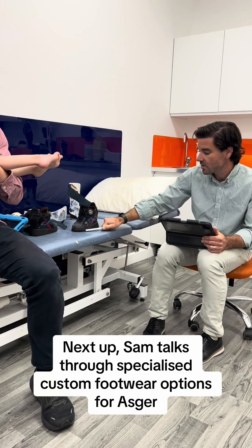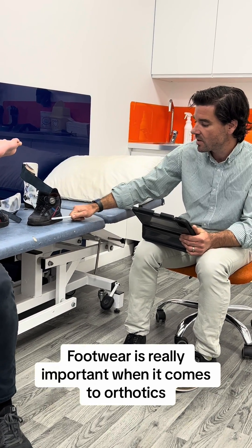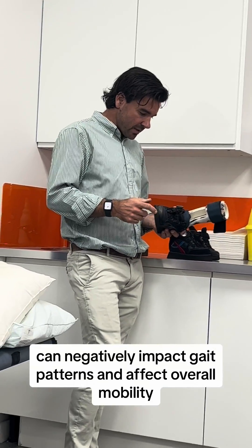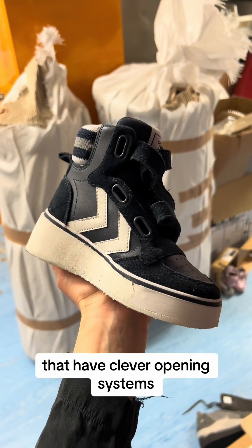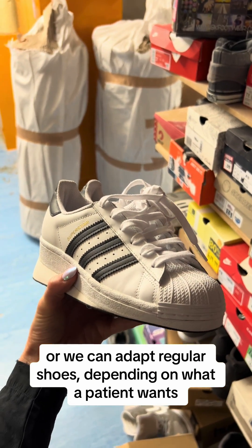Next up, Sam talks through specialised custom footwear options for Asger. Footwear is really important when it comes to orthotics — even a really well-made pair of AFOs with the wrong footwear can negatively impact gait pattern and affect overall mobility. We have a whole range of footwear that can be used with our AFOs that have clever opening systems, or we can adapt regular shoes depending on what a patient wants.